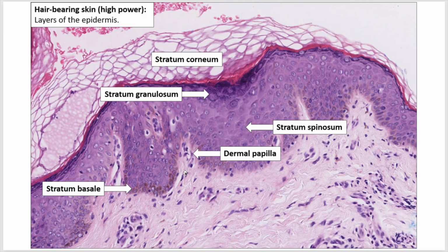And below that, we can see there are abundant dermal papillae. The dermal papilla is the area that has abundant blood vessels or capillary vessels. And the blood flow goes into these papillary vessels to provide the nutrition and the oxygen to give support to the epidermis. So the dermal papilla is also a very important structure.